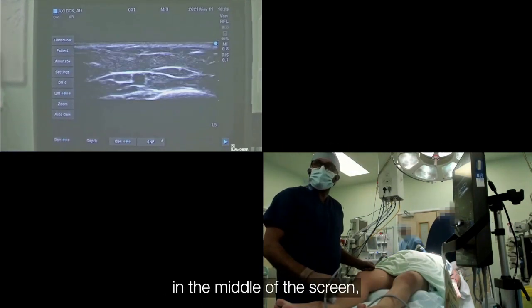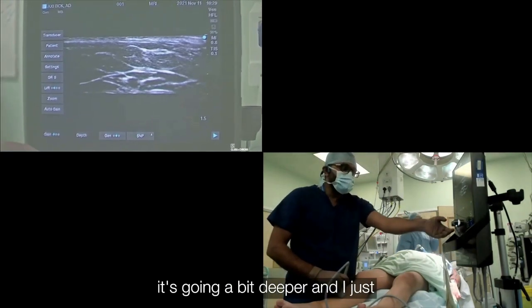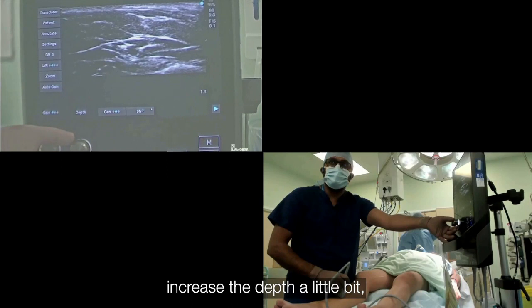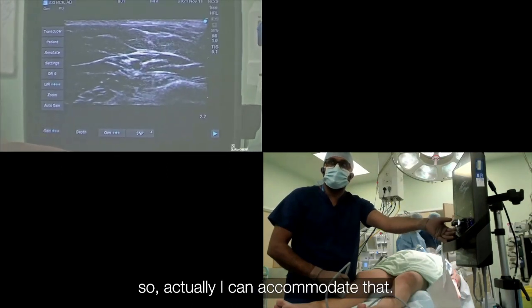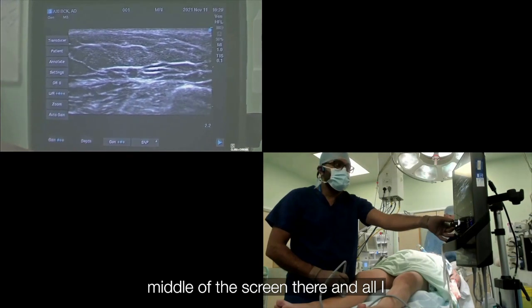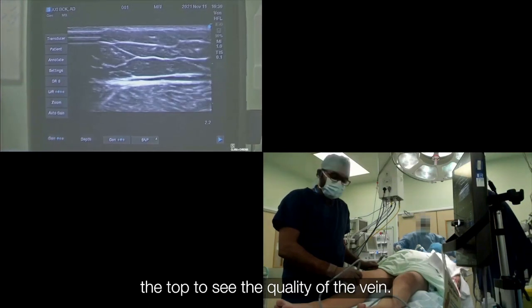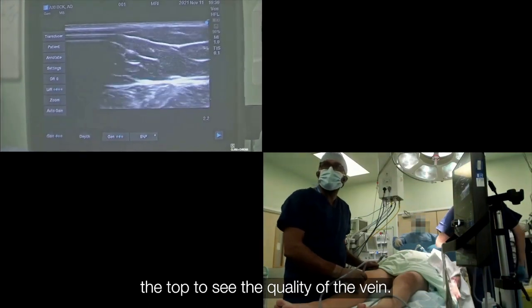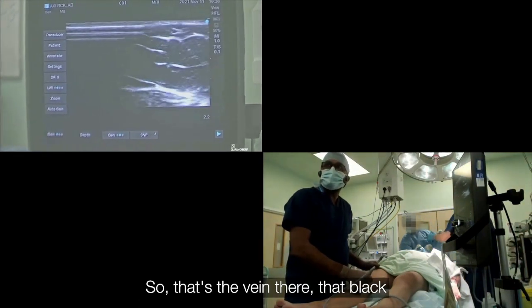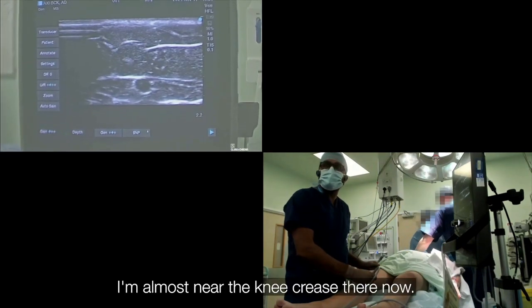All you do is keep that vein in the middle of the screen. You can see as it goes along, it is going a bit deeper. I just increase the depth a little bit so I can accommodate that. I can still see the vein in the middle of the screen there. All I do is just follow it up all the way to the top to see the quality of the vein. That's the vein there — that black dot. Now it's going deep, and I am almost near the knee crease.